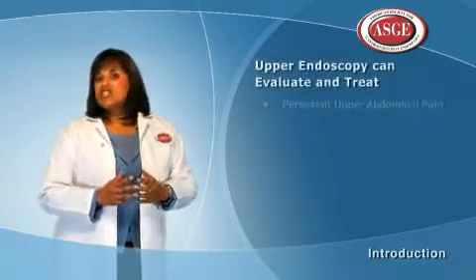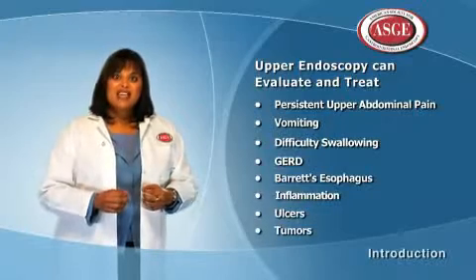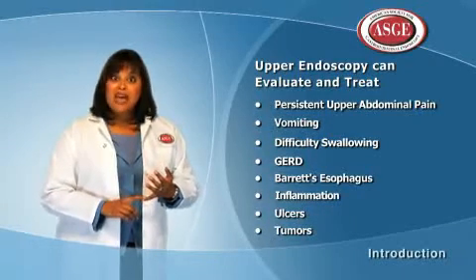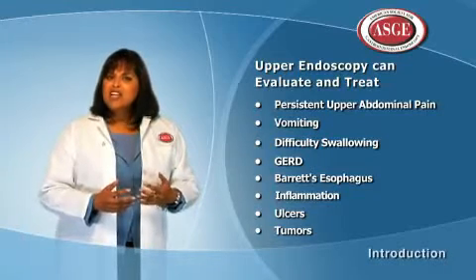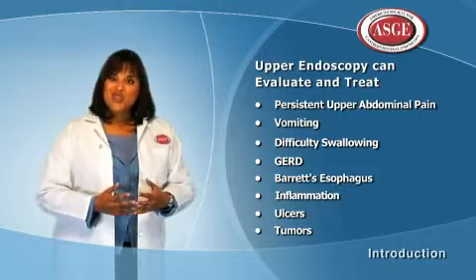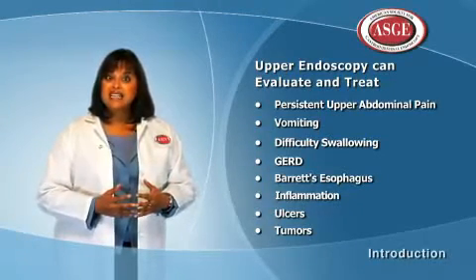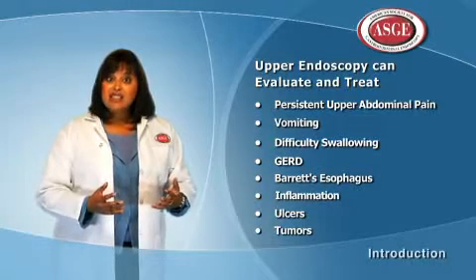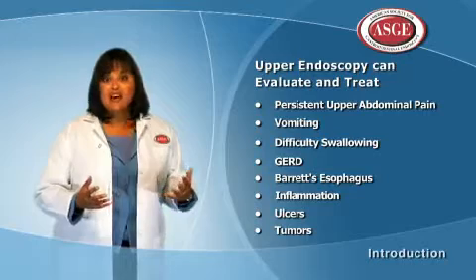There are many conditions that upper endoscopy is used to look at and treat, including symptoms of ongoing upper abdominal pain, vomiting and difficulty swallowing, examination of heartburn or gastroesophageal reflux disease, also known as GERD, which affects approximately 30 million people in the United States. Barrett's esophagus, a potentially premalignant or precancerous condition that can lead to esophageal cancer.